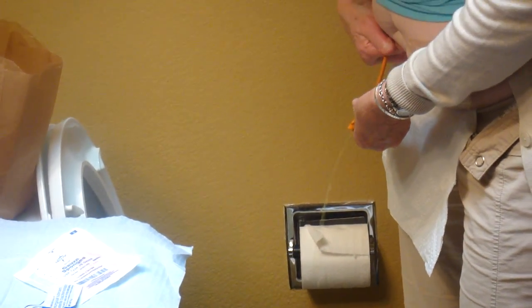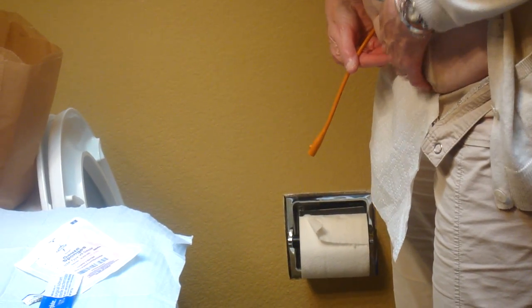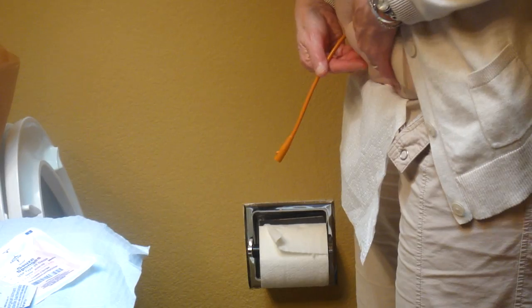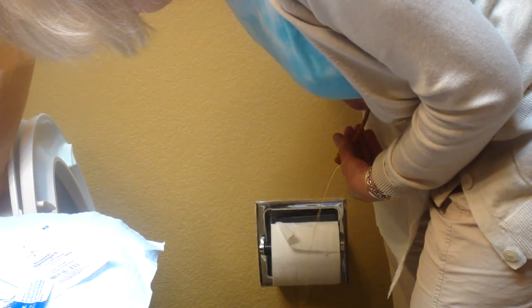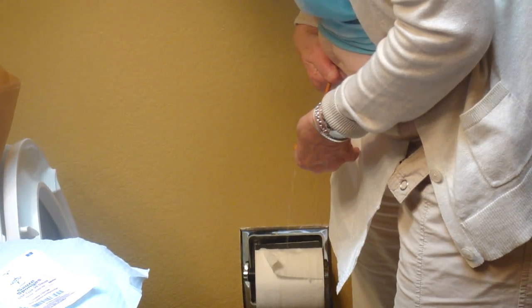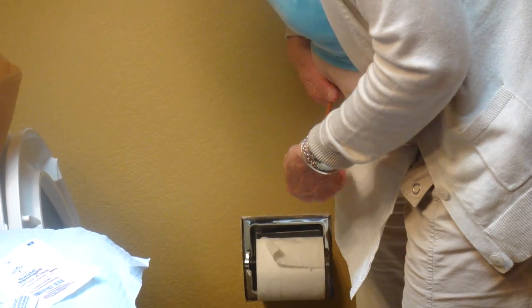If I think there's more urine in the pouch but it's not coming out, I'm going to press gently over here on the other side. You can't always do that in the beginning — you have to wait several weeks after surgery before you can do that because it will be tender. Sometimes I lean to one side and may get a little more out. You can work the catheter in and out a little bit to get more urine out, because you want to try to empty the pouch as thoroughly as you can. I think I'm empty there.